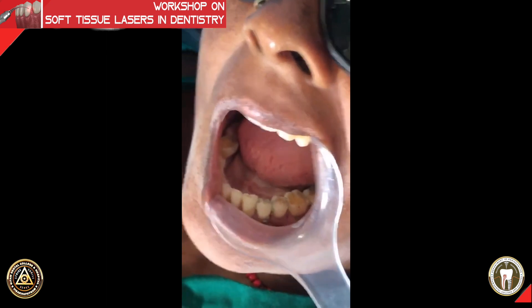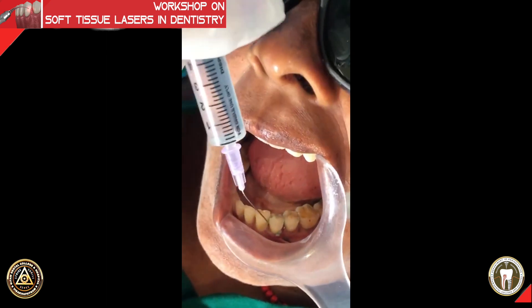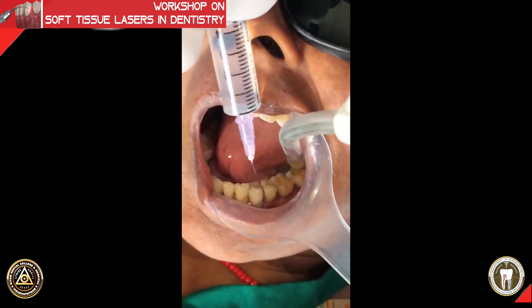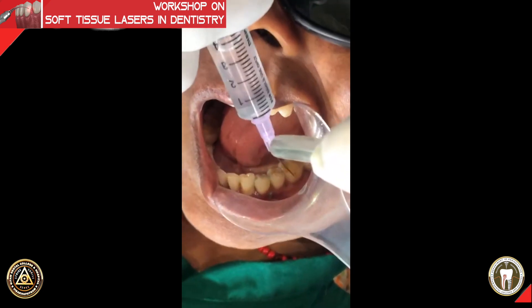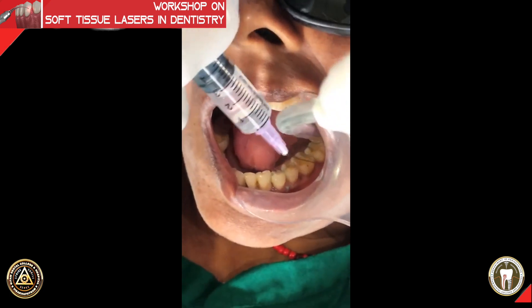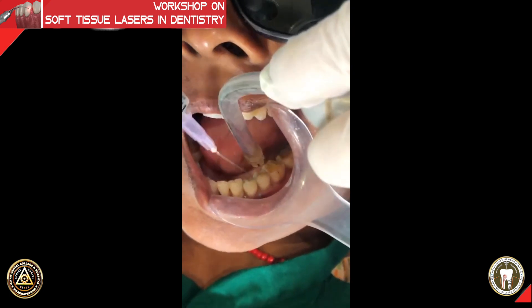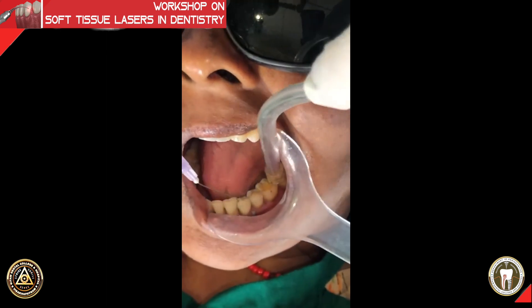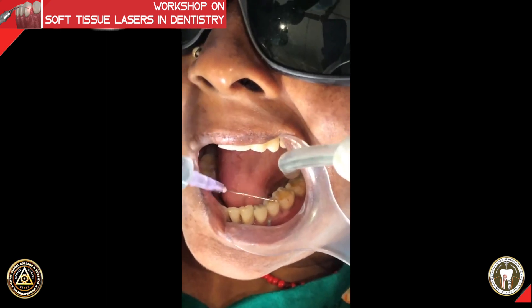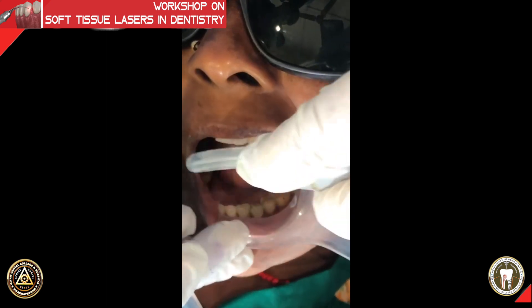One minute is now over, so we are going to flush out the excess dye.